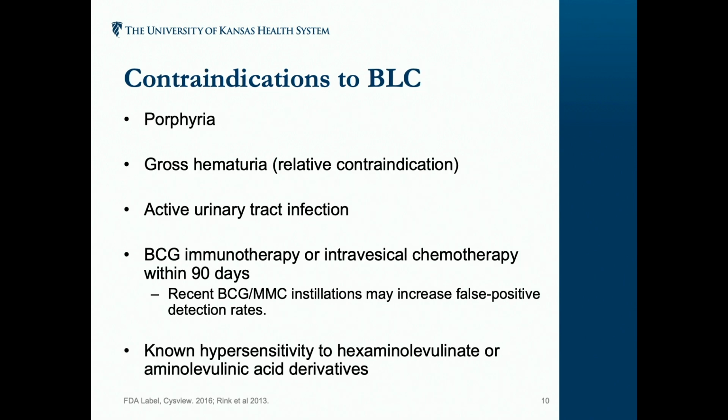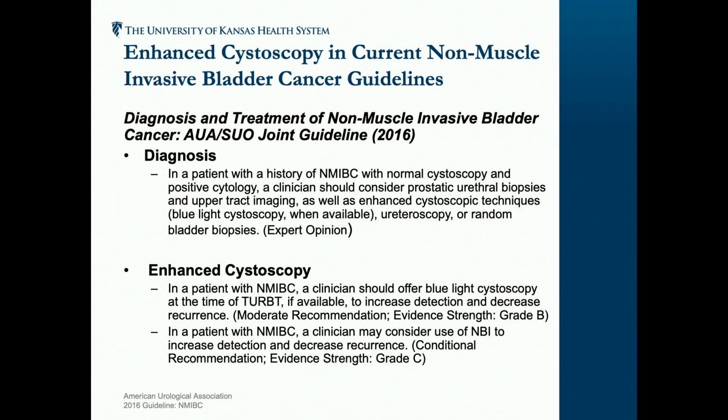Here are some of the contraindications, and again, the main one really is porphyria, which I've never seen a patient with, but anyway, that would be the main contraindication, or sensitivity. I haven't had any bad reactions to HAL. I mentioned this again, so these are the guideline statements.